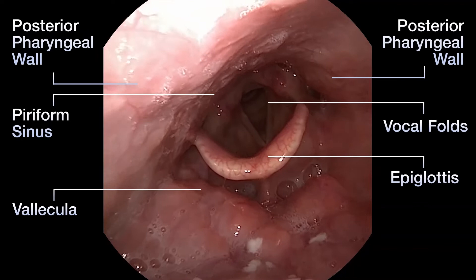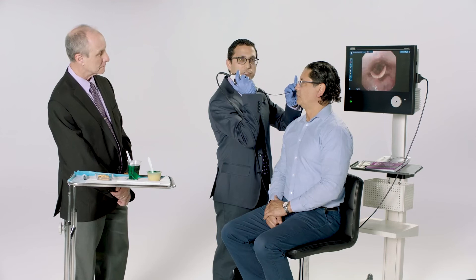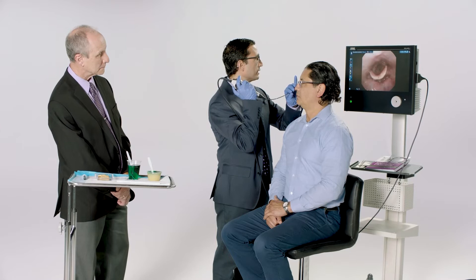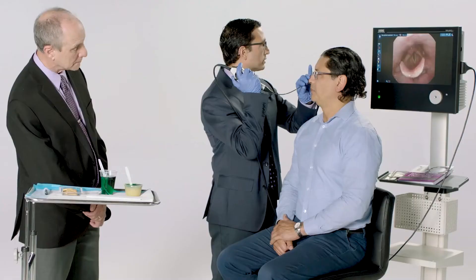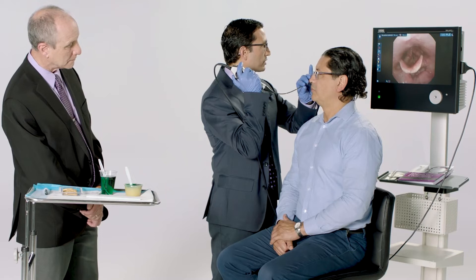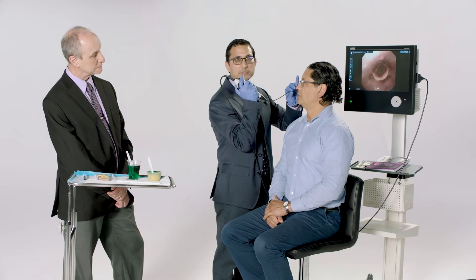I'm going to stop at the level of the palate so I can see the entire swallowing apparatus. I'm able to visualize the vallecula and the larynx. Generally, if you want to evaluate the function of the larynx, you have the patient phonate. Could you go ahead and say E? — Eeeee. The vocal folds are working properly, larynx function is normal, and there is no pooling of secretions. We're now ready to test the patient with different food boluses, starting with the safest and easiest — pureed food consistency.